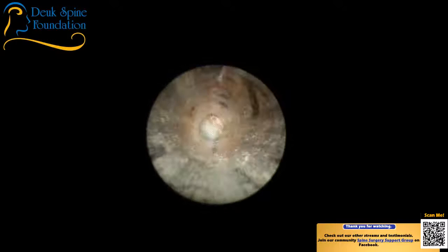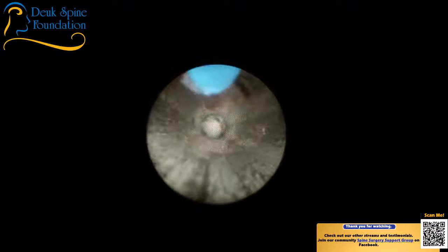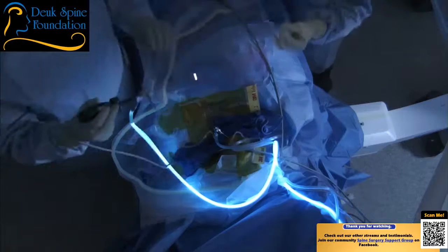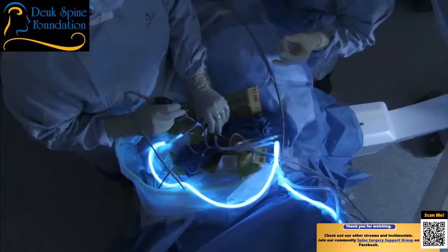I've got about 10 minutes max left. So on the anesthesia — if you want to start winding her down a little bit. I definitely don't need any more. Oh, look at that herniation — wow. That thing just popped out of the foramen. I've redirected more lateral to get more lateral in the foramen, because I can still see there are fragments in there on the nerve root. That's a huge piece of herniation — I'm going to try to loosen it up some more and see if I can get it out.